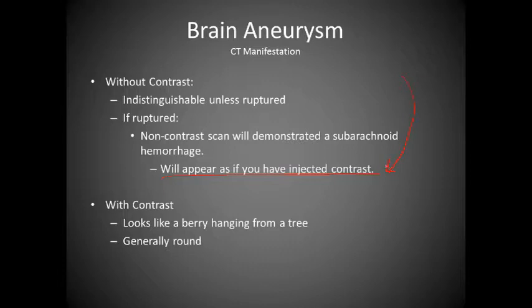This is something I've actually experienced with some of my patients, this appearance of injecting contrast when you hadn't. We had a lady in her mid-50s, and she was complaining of severe headache, nausea, and vomiting, just sudden onset, quite severe.